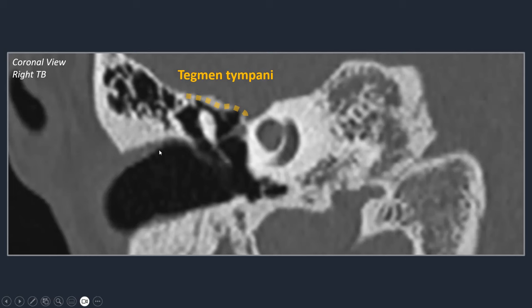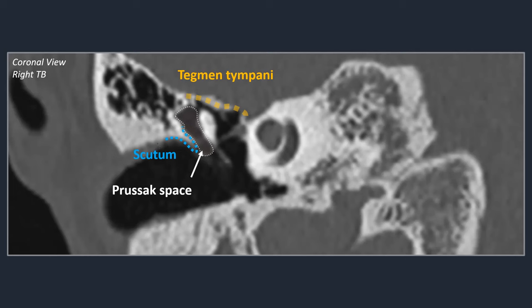The scutum is an important landmark, and the space between the malleus and the scutum — called Prussak's space — is located between the flaccid part of the eardrum and the malleus head. Cholesteatomas commonly arise in this region, making Prussak's space a very important anatomical area to inspect in patients suspected of having a cholesteatoma.